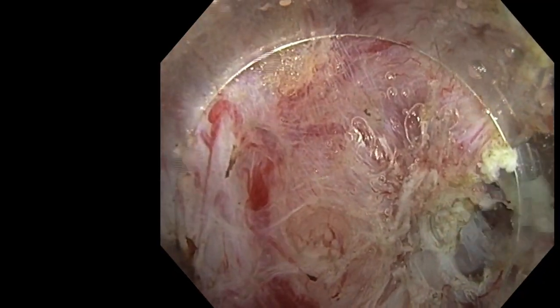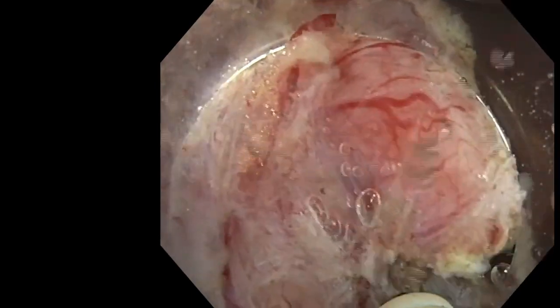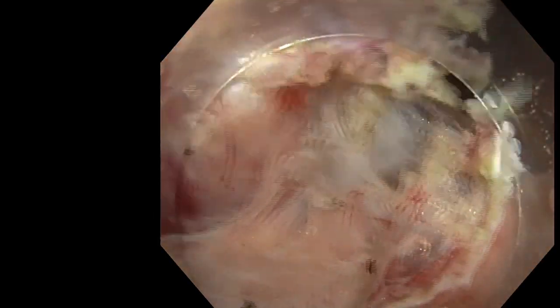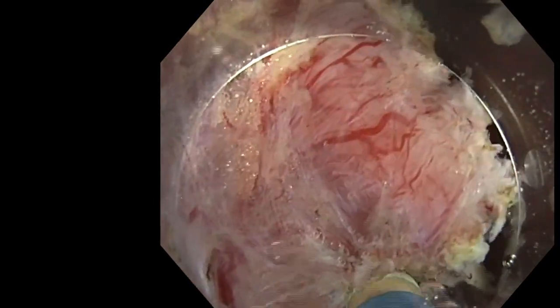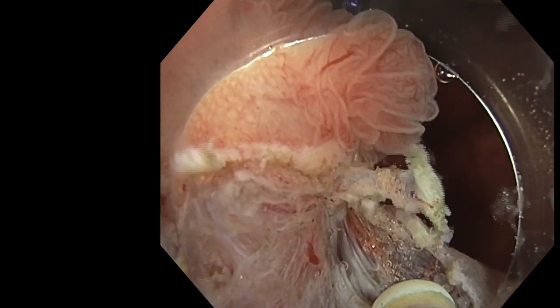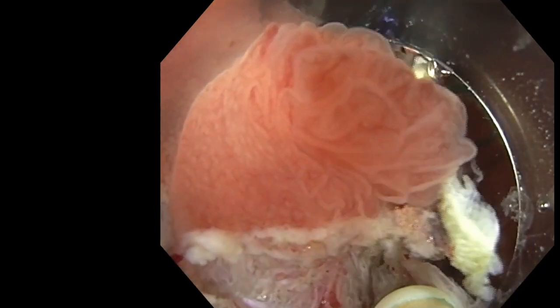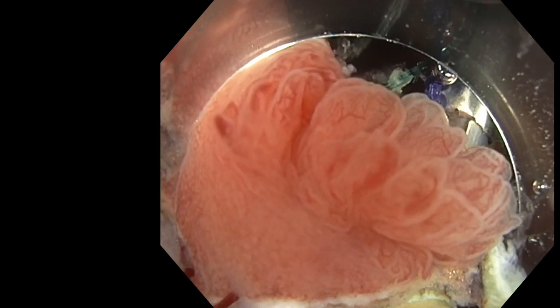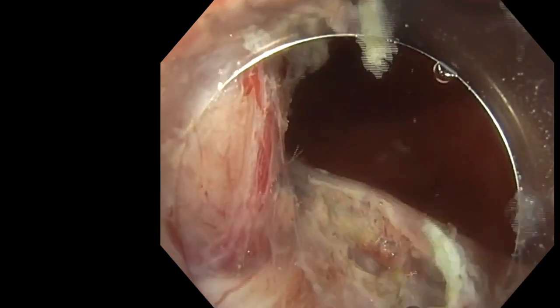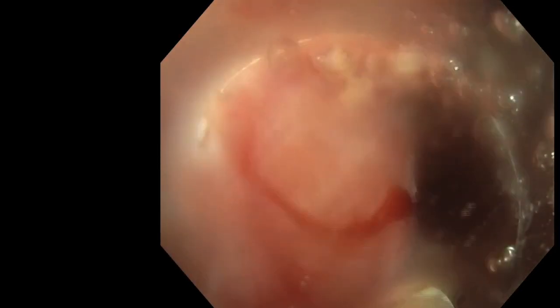In this case, because the walls seem a little fragile after this, we prefer to close everything in order to prevent a delayed perforation or a delayed diverticulitis. So we closed all the area. Here we can see, okay, small bleeding on the side. We can see that there are a lot of vessels around the diverticula.